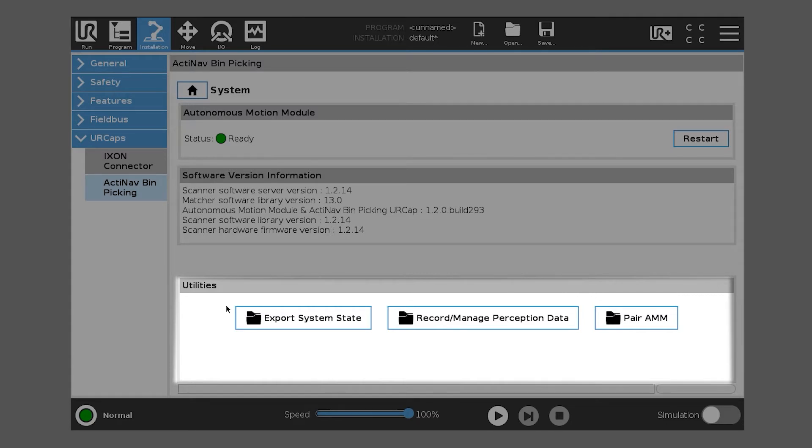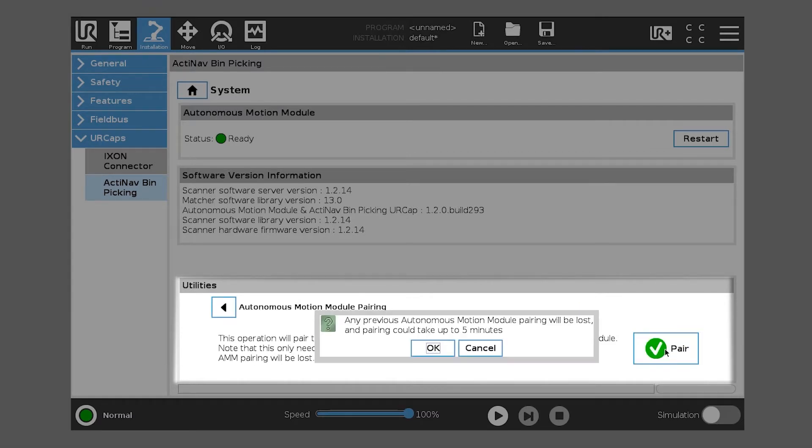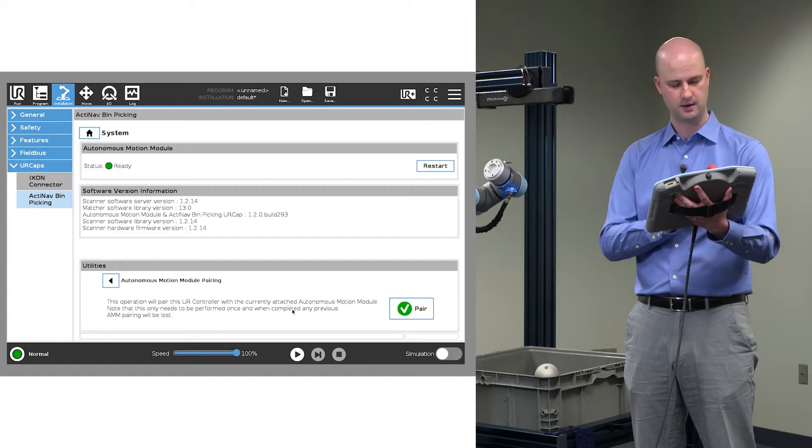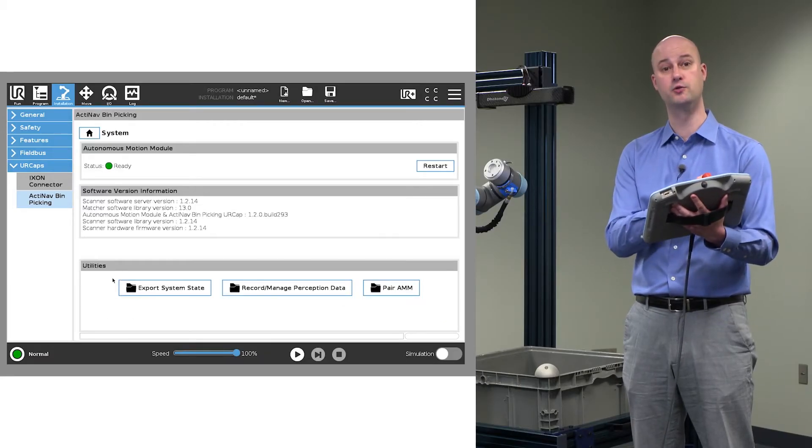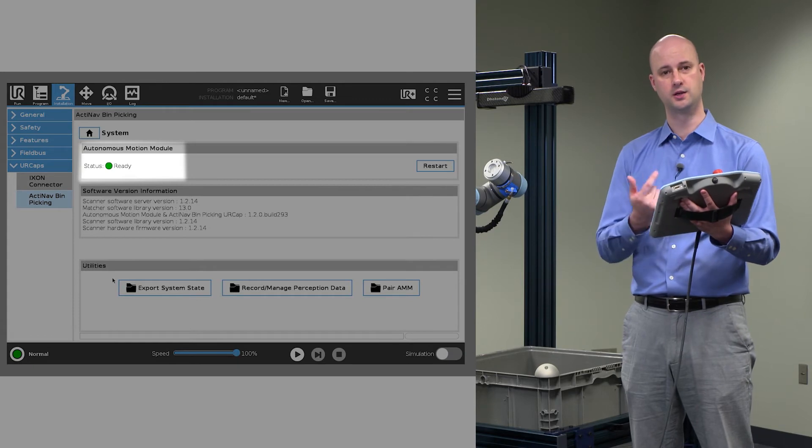That's going to be Step 1. Click Pair AMM, you'll see a nice big Pair button, and you go ahead and click Pair. In this case, we're already paired, and they're already actively communicating, as indicated by the green Ready Status button.